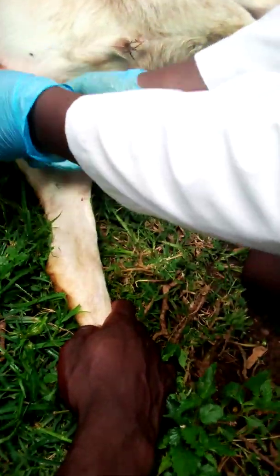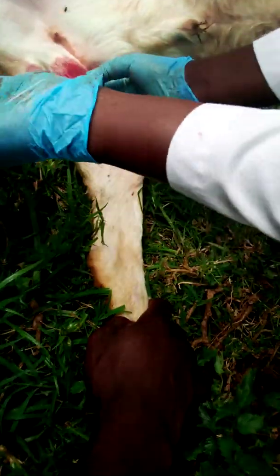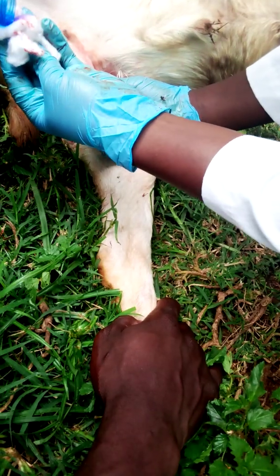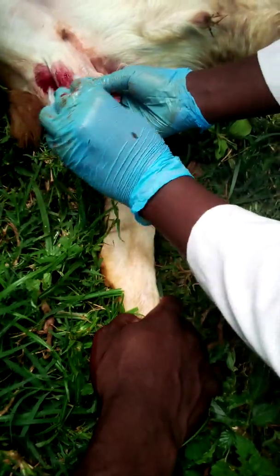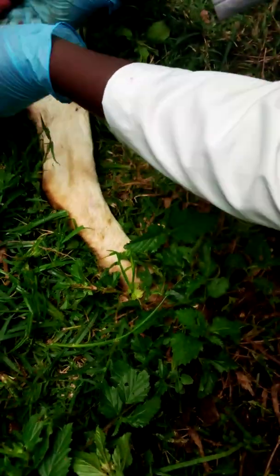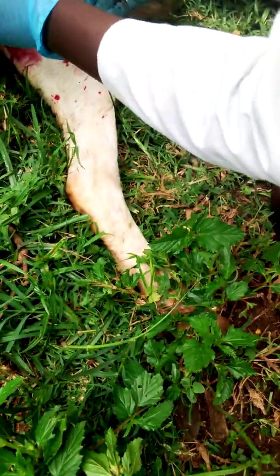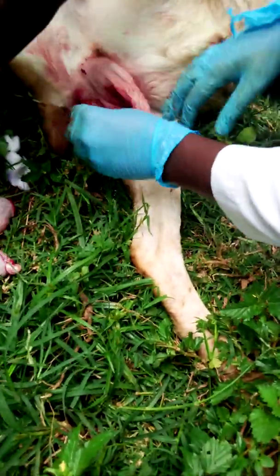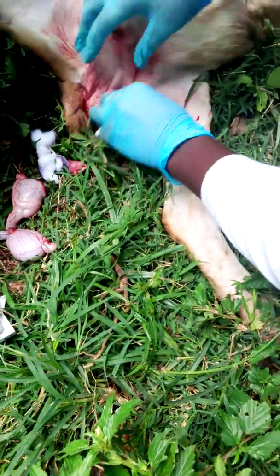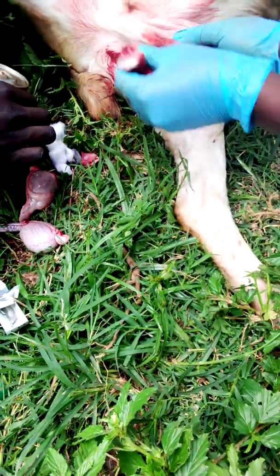Where is spirit? It's here. Cotton is here — you give a cotton, you put spirit, just pour. Even the other side — it's even paralyzed, it's tired. Start cleaning the whole scrotum first, clean using that cotton, remove all that blood. Then you first put healing oil inside, then you spray the whole scrotum. We don't want to apply it. More cotton — it's done.